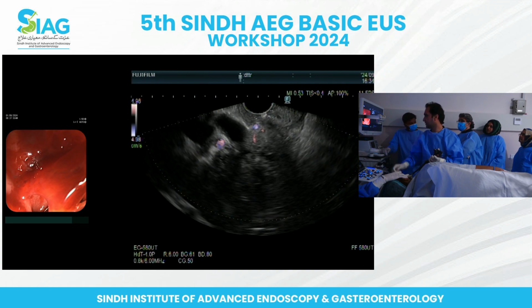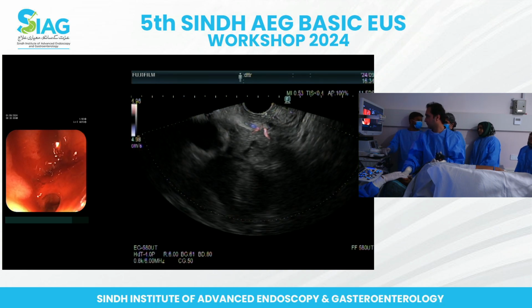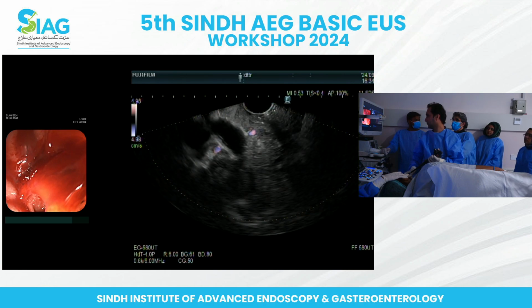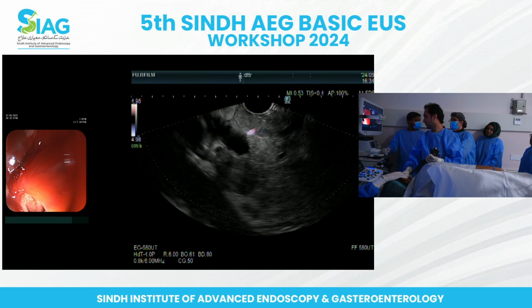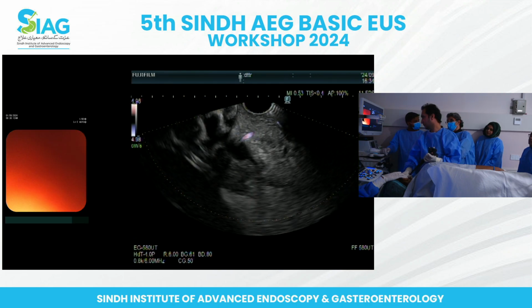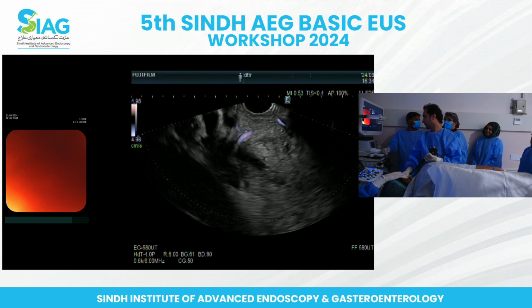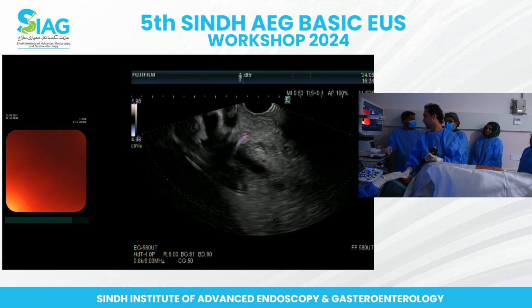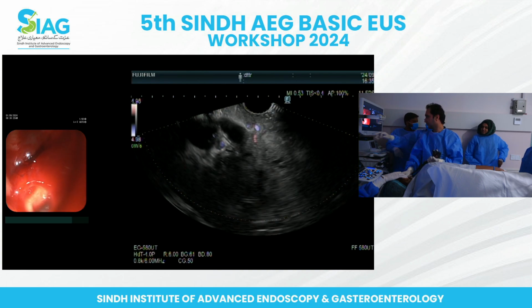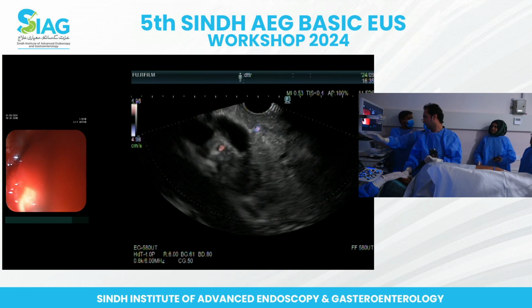So that's the bile duct right on the top, if you guys can see on that screen. And that's the pancreatic duct there. And Junaid will just show you how the bile duct will walk into this mass. Keep going to the clock. You were doing fine. Keep going. There you are. Can you even see that? But also see that it's not completely obstructing the bile duct. Can you see that, everyone? Go back to the anti-clockwise, please. So that's the mass, that's the duct, and he's just going to walk us through it very slightly, clockwise.